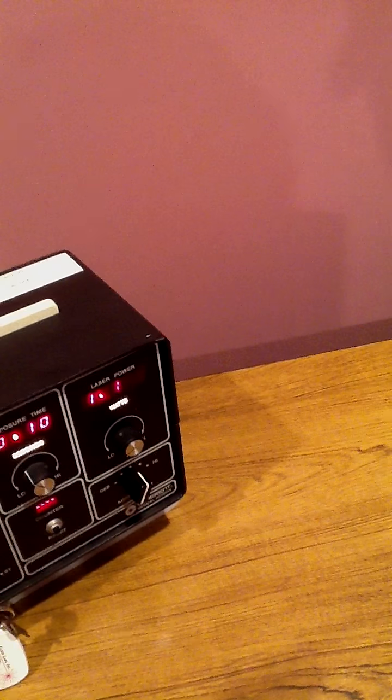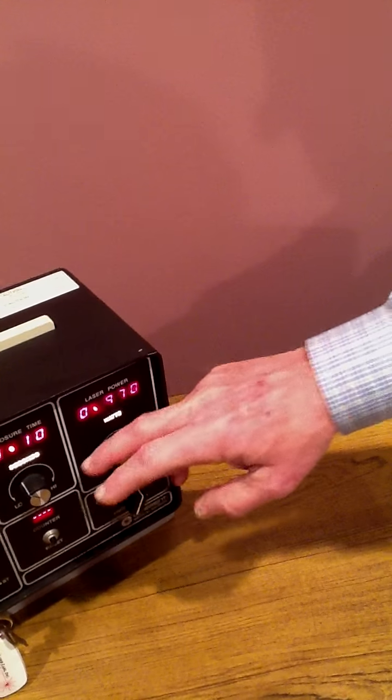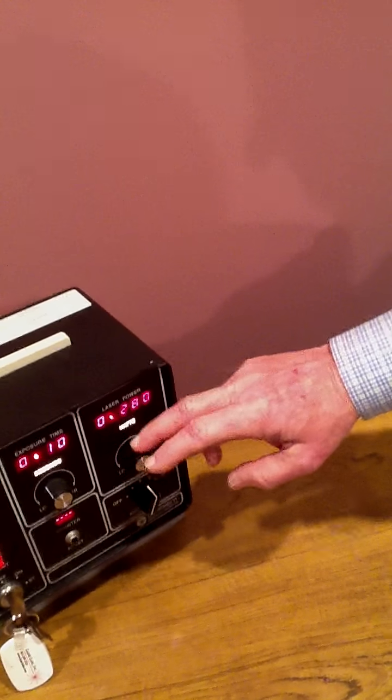There we go. Now let's dial it up to the maximum power — not that we use it. 1.1 watts is very good. Usually it's used between 200 and 300 milliwatts basically.